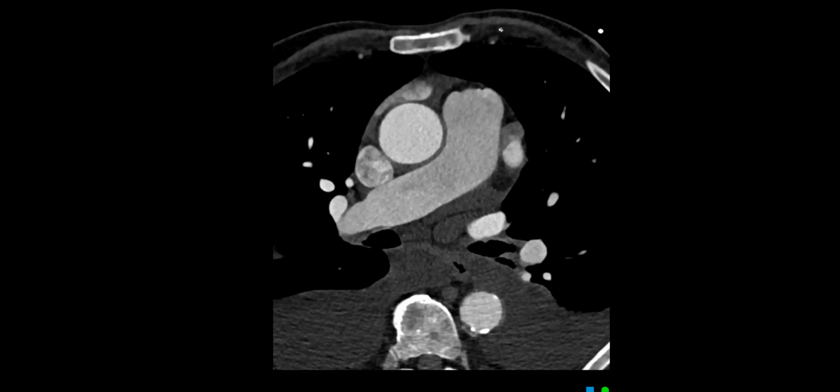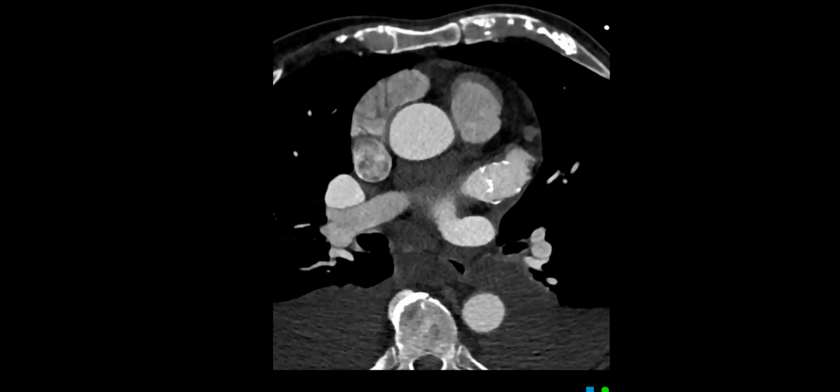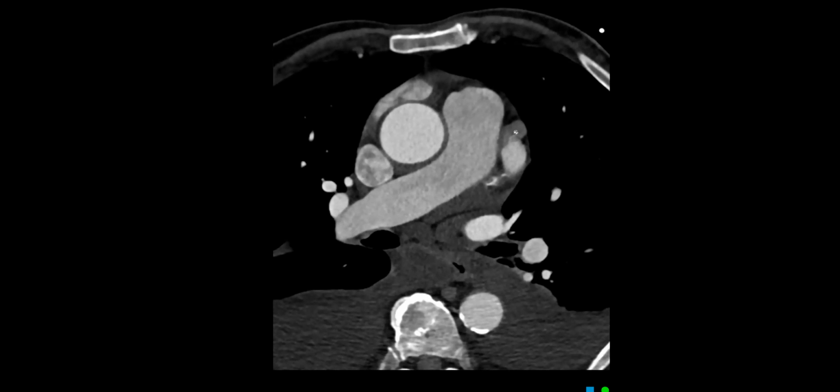Actually in our center, when these TAVRs are done outside of clinical hours, they usually wait for the final read. We don't dictate it. We just look at the really important findings which need an immediate phone call. And this finding was missed. Obviously it has to be fixed, but this would not be of major immediate concern, I suppose.